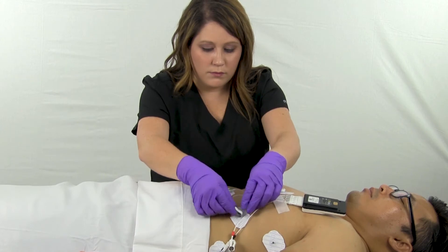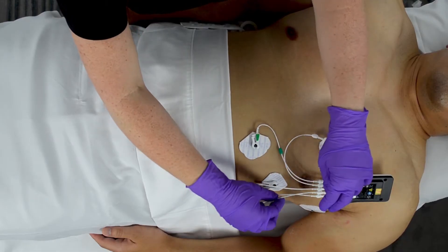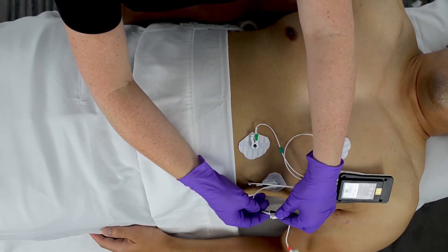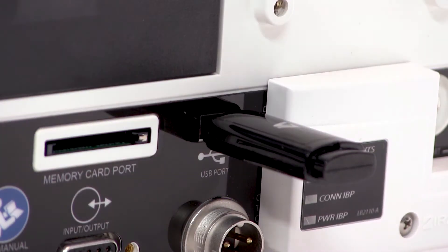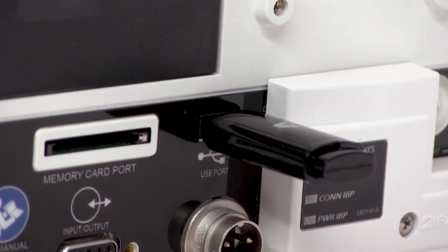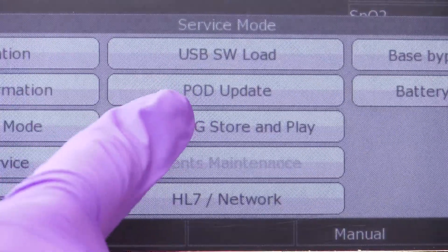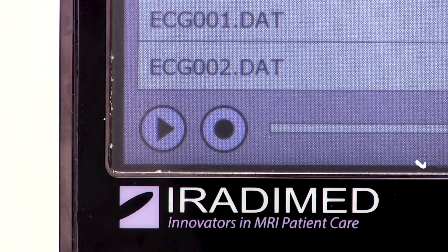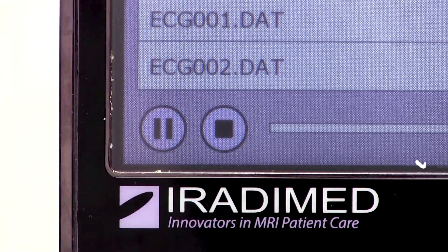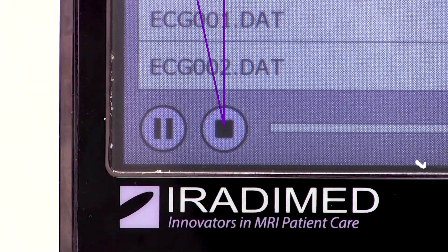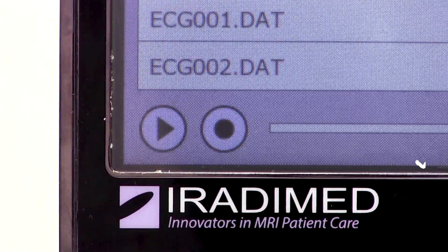To record, ensure that the patient application has optimal QRS amplitude and follow steps one through three from video two. Insert a non-magnetic USB drive into the rear of the 3880 and enter the raw ECG recording feature in the service mode menu. Press record prior to starting the MRI sequence and take notes of the MRI scan protocols. When the scan concludes, stop the recording and provide the files to iRaDaMed's technical support team.